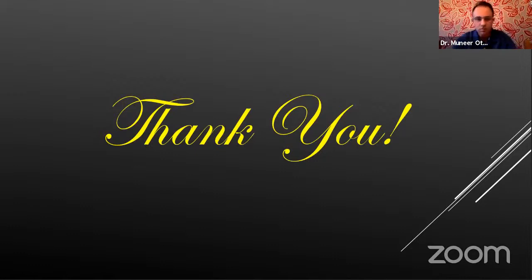So, yeah, I don't know. What do you think about the visual field index? Do you usually check it along with the mean deviation, or you are not very interested in this?